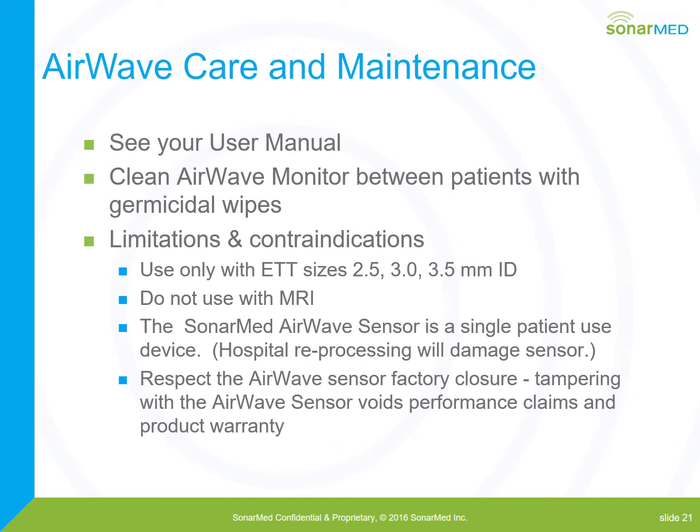And the monitor itself is factory closed, as well as the sensor. Tampering with that in any way is going to void any kind of product warranty, but it also is going to possibly cause performance problems. So respect the AirWave factory closures.